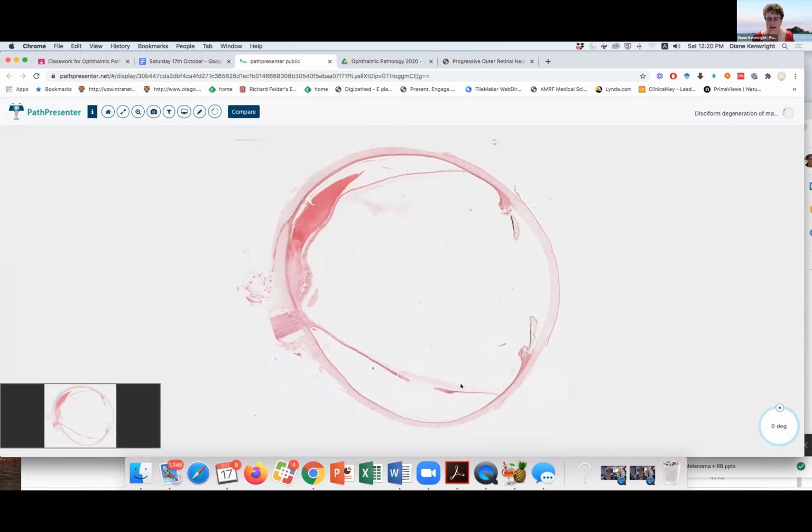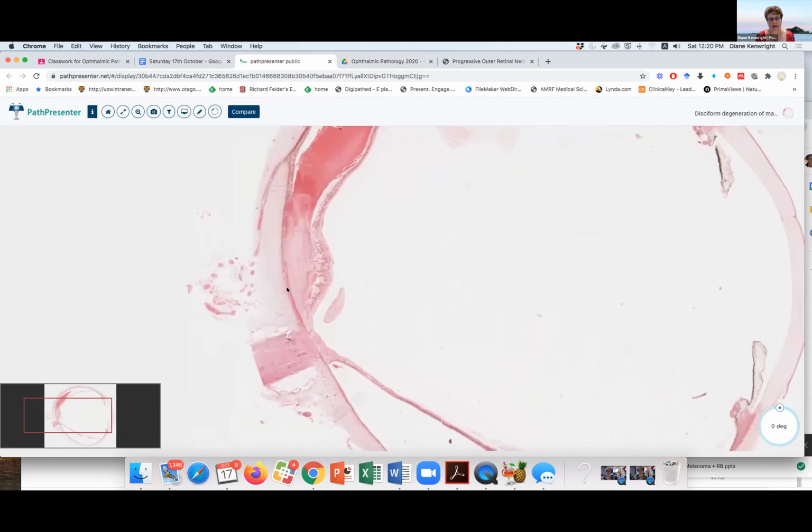Ciliary bodies look all right. There's a hole in the retina here. That's a bit interesting. There's separation, which may well be artifactual here, but here there's separation by hemorrhage and there's a mass at the back. There doesn't appear to be a cup. However, the optic nerve does not show the flaring waist thinning out of the back here. And the meninges look a bit baggy, so I'm a bit concerned that there is in fact optic atrophy here. Let's start by looking at the mass.